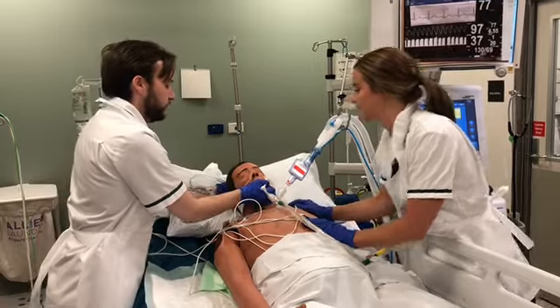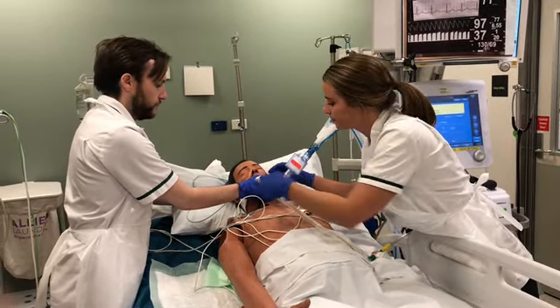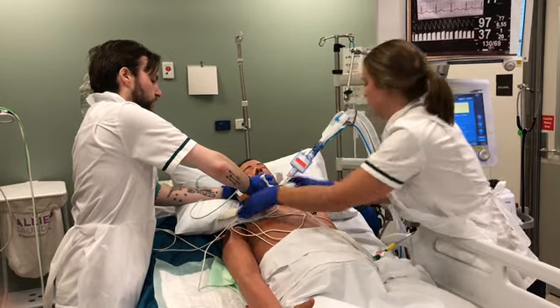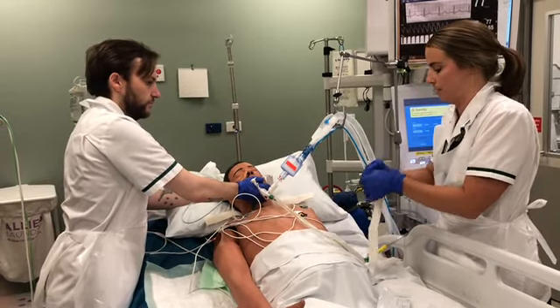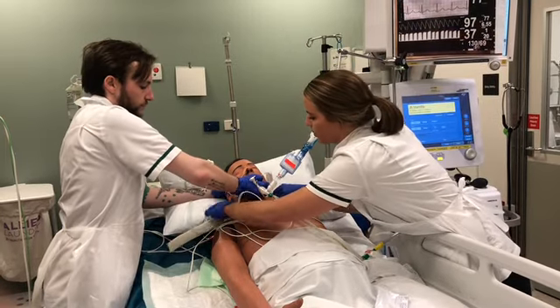Perfect, that's great. Alright, loosening the tapes there. And the far side. Looks great. Grabbing the new set that you got ready earlier. Just bringing those through.